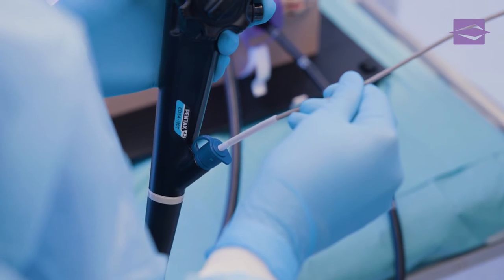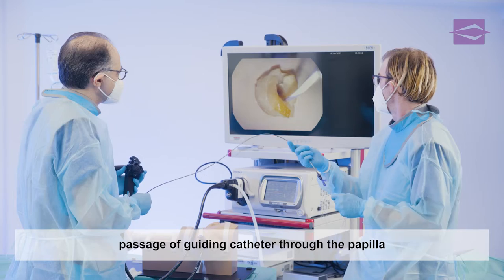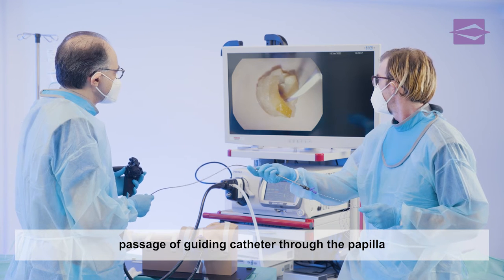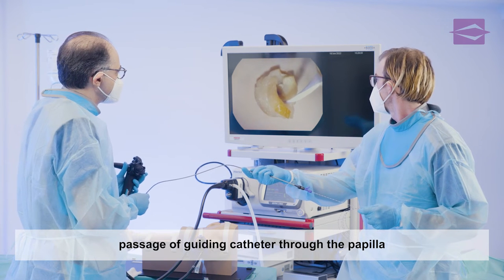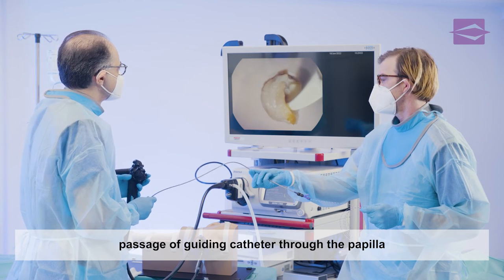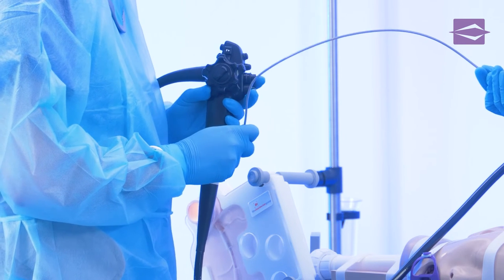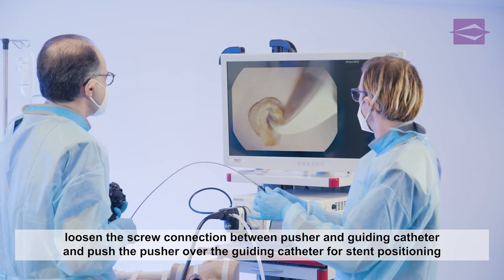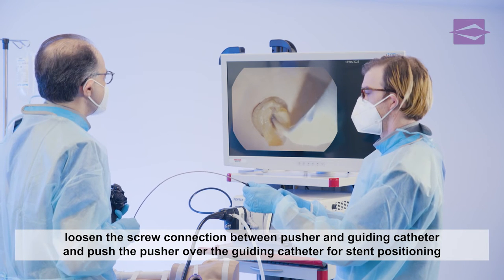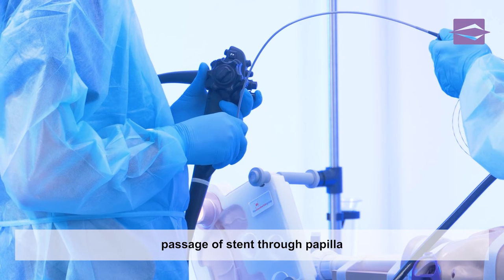Now the positioning sleeve can be moved away over the pusher in a proximal direction. The examiner slowly advances the placement set over the guide wire under monitor control until the guiding catheter passes the papilla. The assistant loosens the screw connection between the pusher and guiding catheter. The stent is now brought into its transpapillary end position simply by advancing the pusher.